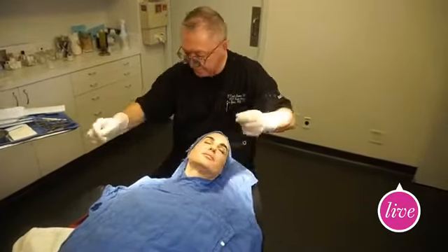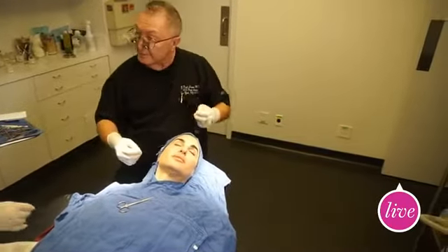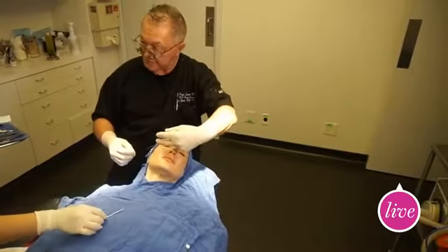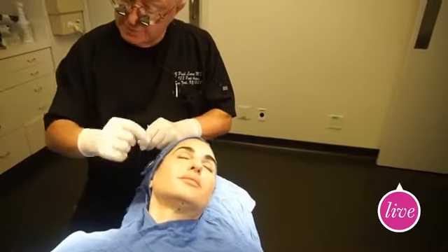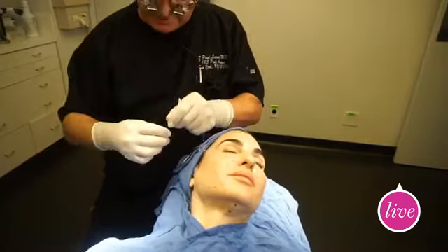Carrie, can you cut for me, please? So is that one suture finished? Half a suture. The cones are sitting right now this way, facing up, and the cones on the upper portion are facing down. These cones will be used as an anchor, and then everything will be advanced towards these cones.